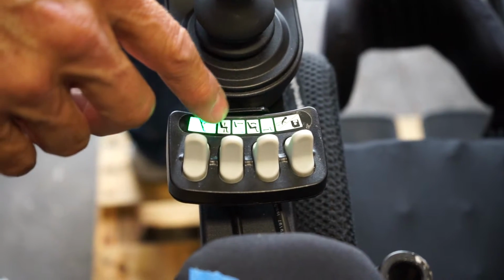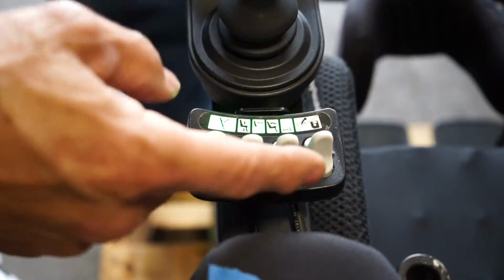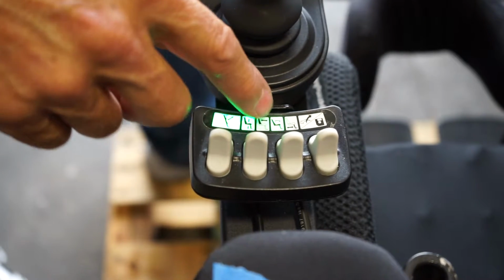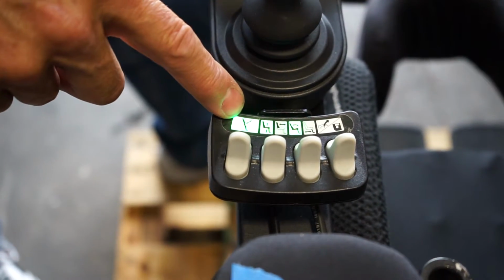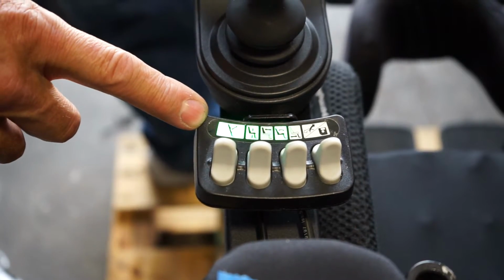If you want the seat lift or the recline, which is the fourth button, you've got to switch over. So you hit this button here, and it switches the lights over now to this one and this one. It takes the lights off of these two, okay? So this is how your functions work, okay?